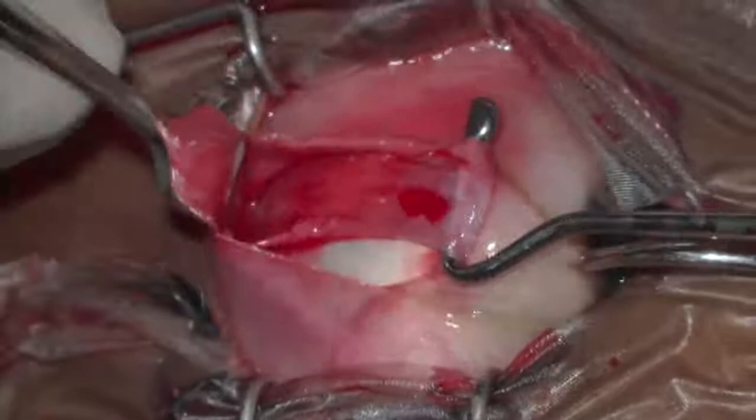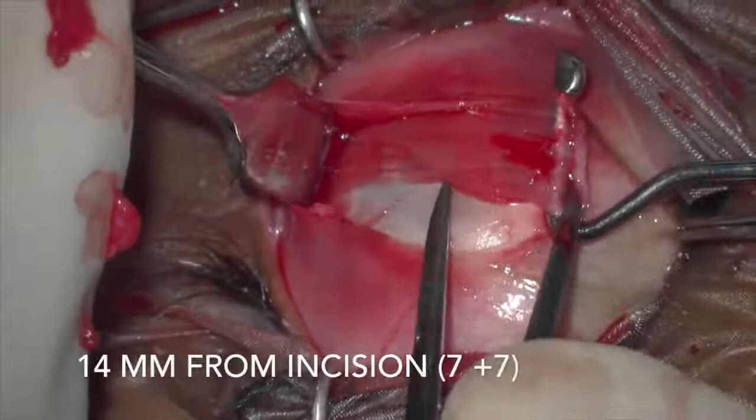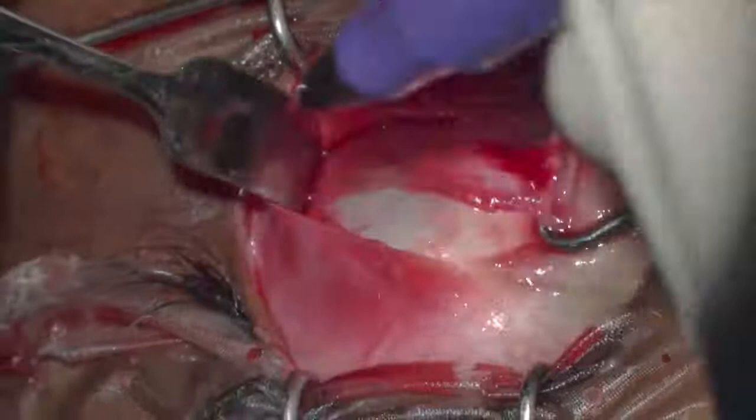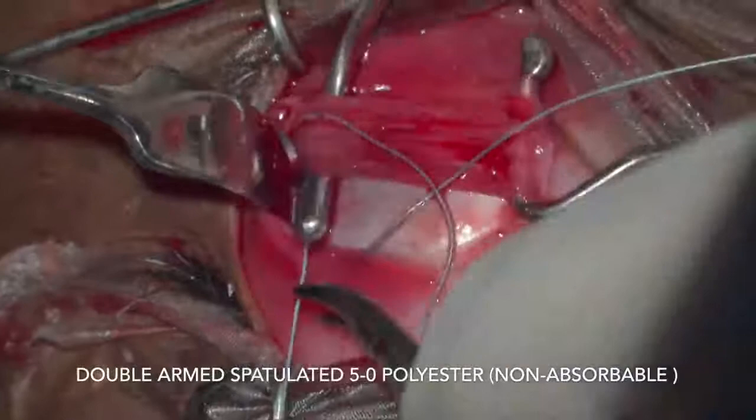14 mm is measured from the muscle insertion in two steps of 7 mm and a mark is placed. A 5-0 non-absorbable polyester suture is then used to take a full thickness bite through half the width of the lateral rectus muscle.